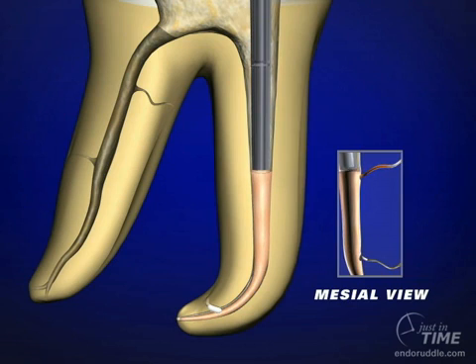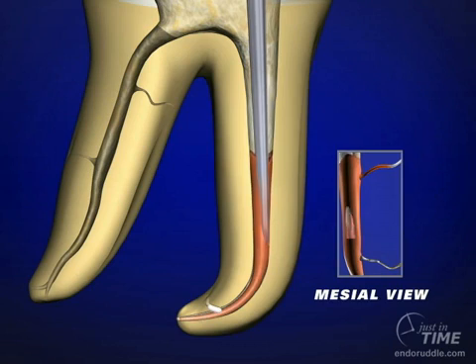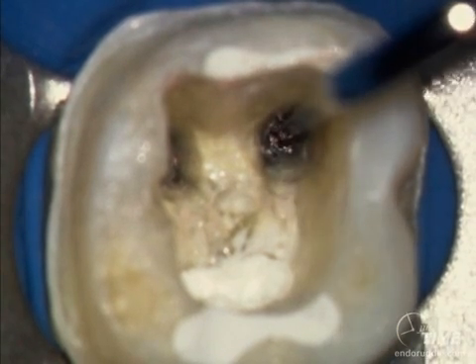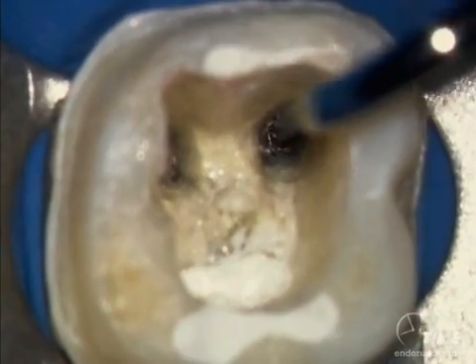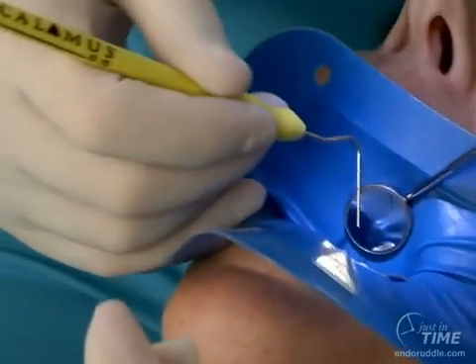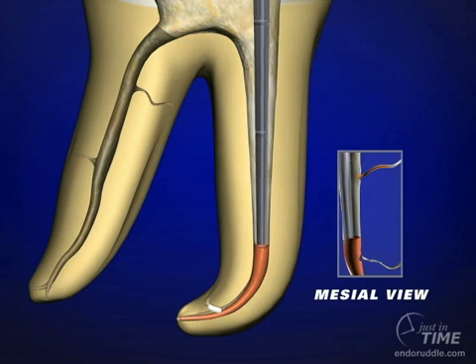Notice the cone is unaltered in its apical extent. Come in cold, activate — the heated instrument is allowed to plunge in 3-4mm, and heat will then travel apical to the instrument to the terminus of the cone. The smallest plugger can be used to mold and adapt the apical gutta percha into the intaglio of the root. Notice the significant hydraulics as we distort the cone and adapt it to the shape of the canal.